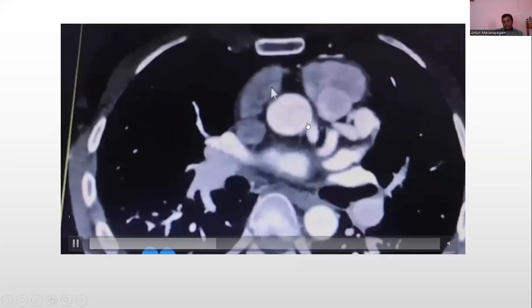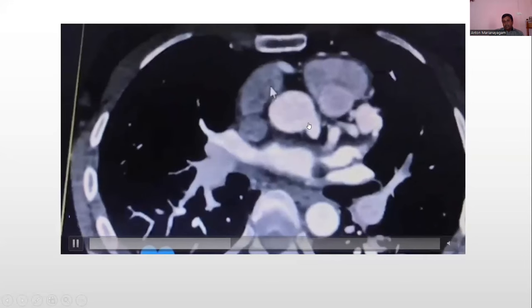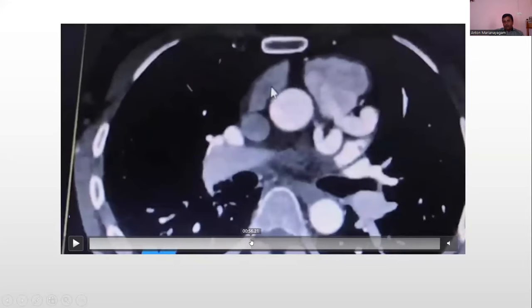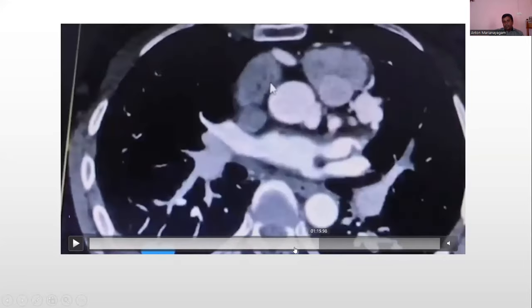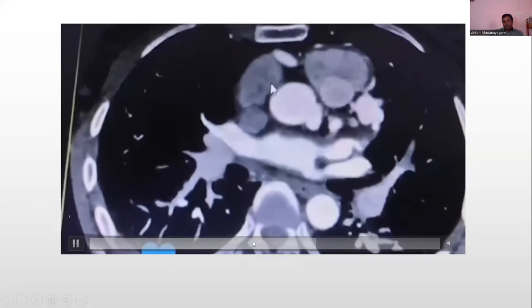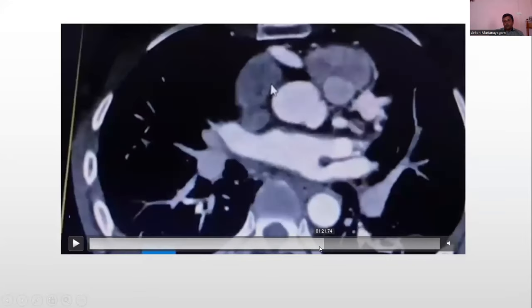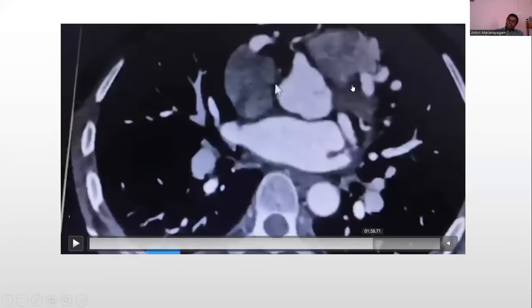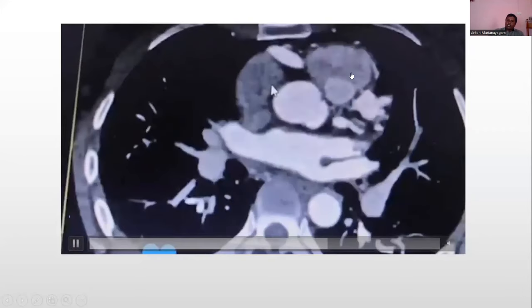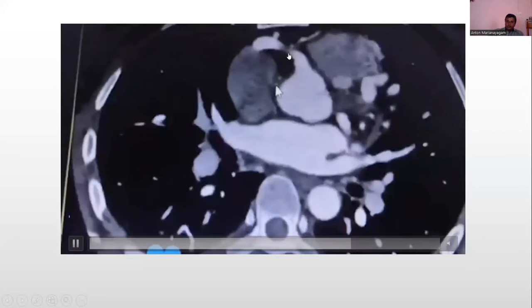But you see the left main trunk is arising from the aorta. And what is going to happen if you go along with this study? Now, if you trace this vessel, this is going into the interventricular area. So that is LAD. This is an anomalous origin of left anterior descending artery from pulmonary artery, not the whole left coronary artery. So this is an extremely rare phenomenon. We had a case in the teaching hospital in Radhapur.